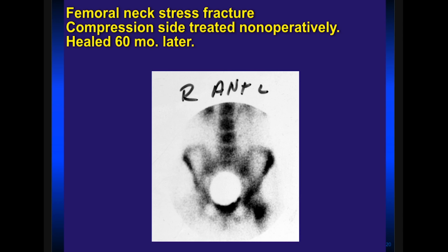In this case, we did a bone scan. This individual continued to have pain. A bone scan was done, and clearly there's increased activity in the medial aspect, or that compression side, and she ended up healing with non-operative management. It took her a while to heal. She did have female athlete triad, so that had to be addressed as well.